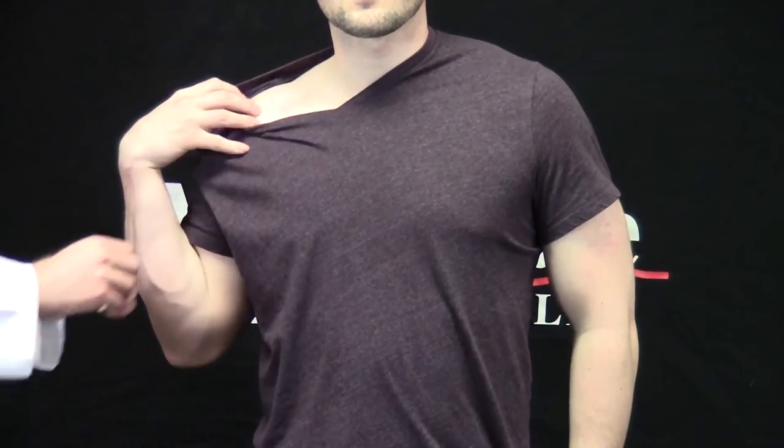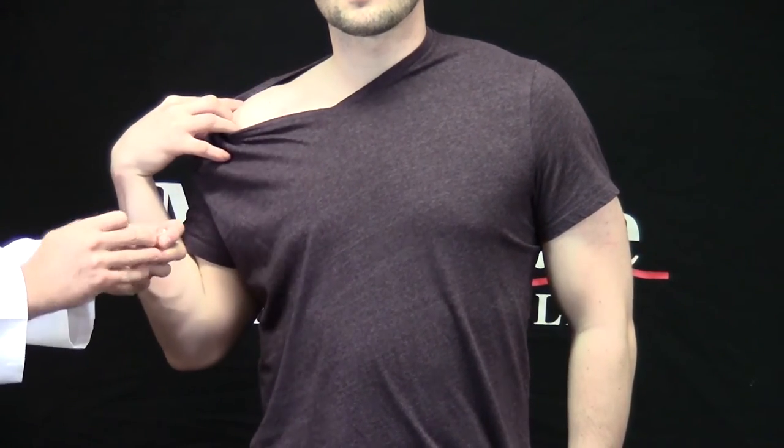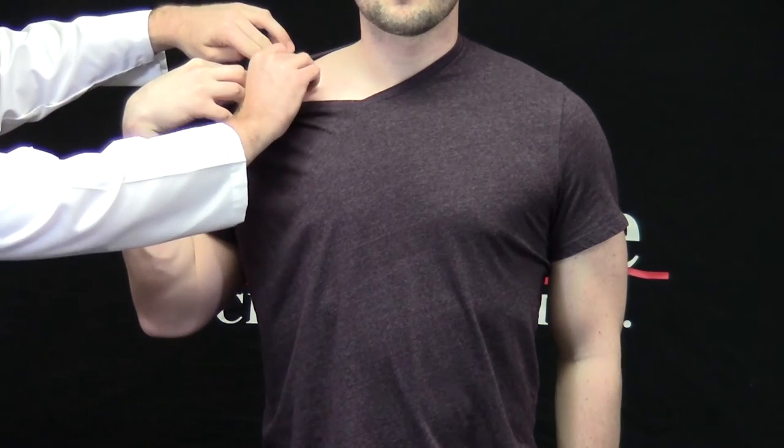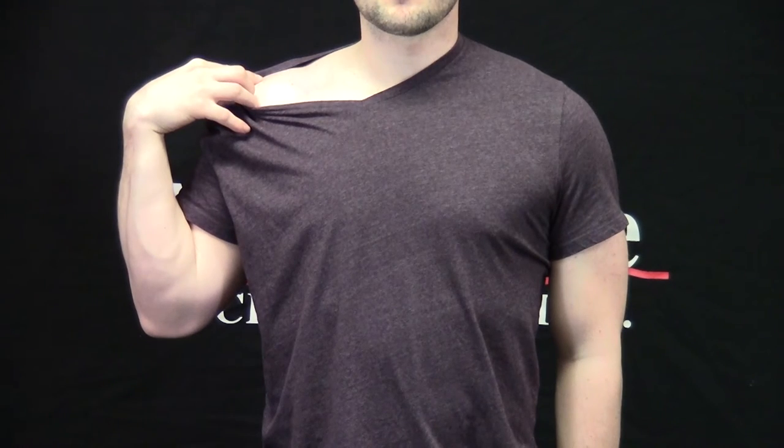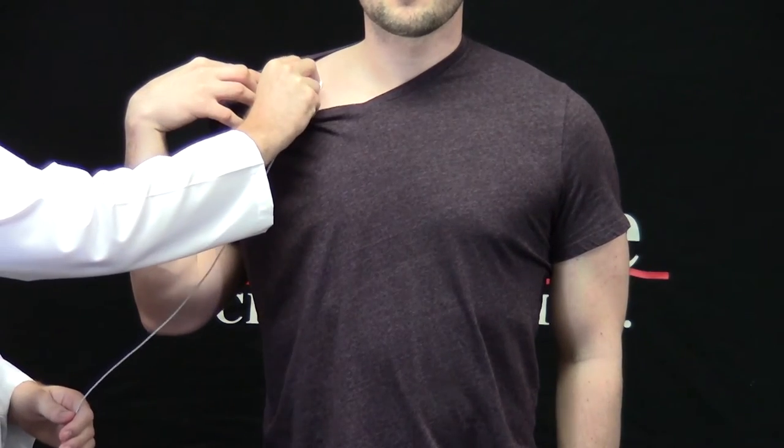I'm going to start by asking our subject to move his shirt collar to the right side, exposing the right clavicle. While he does that, I'm going to remove an alcohol prep pad from its package. Using my middle and index fingers, I'm going to locate the right clavicle and clean the site using the alcohol prep pad. Then I'm going to take an electrode with the lead wire already attached and place it firmly on the site I've just cleaned.